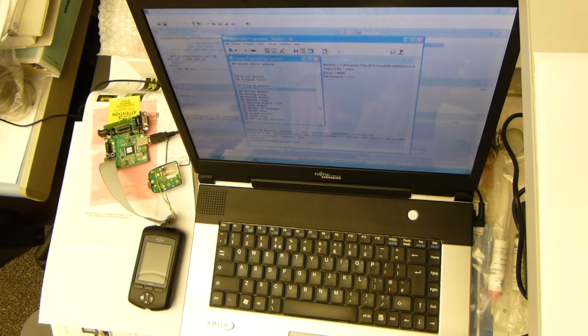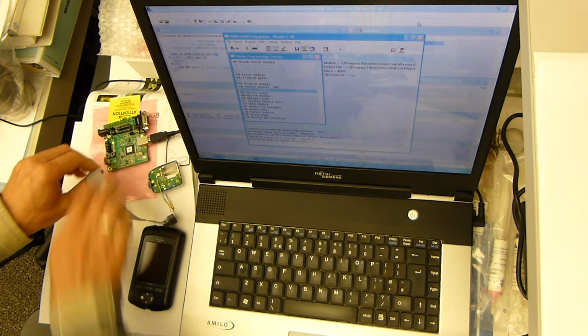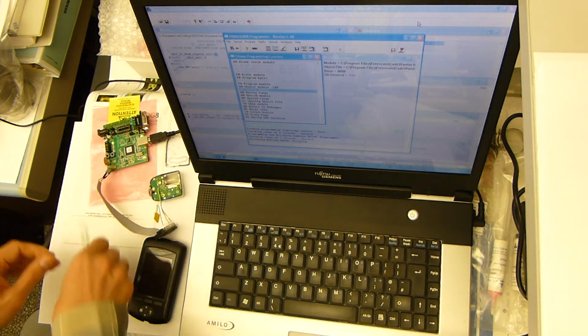We do that. Now we can test whether the flash is empty, and we can program it with the firmware that was extracted from the brand new pod. Press the flash programming button. The flash is programmed. We can verify everything is correct. So now we can unplug the pod, and we also need to reset it by short-circuiting the reset and ground.